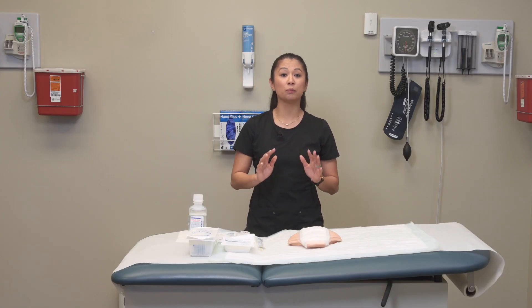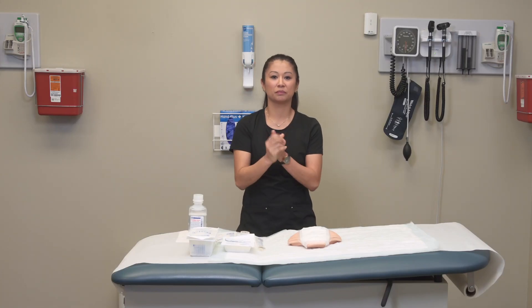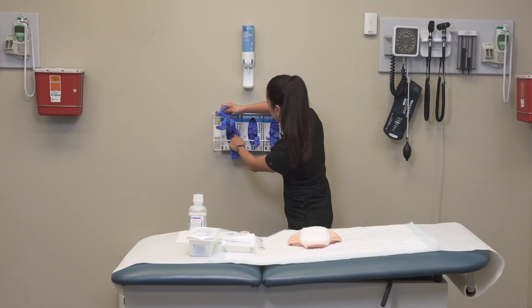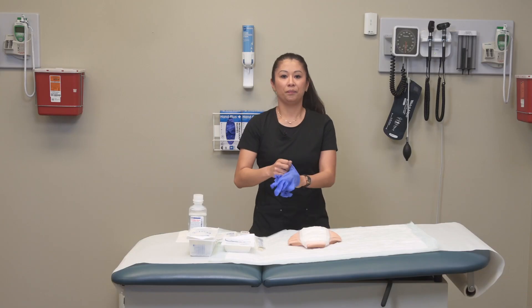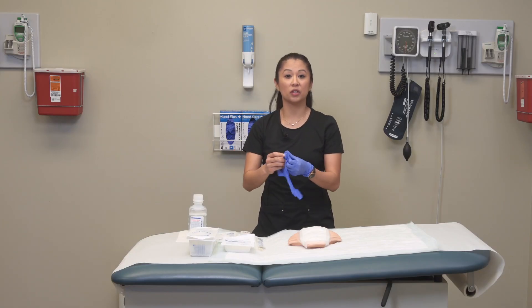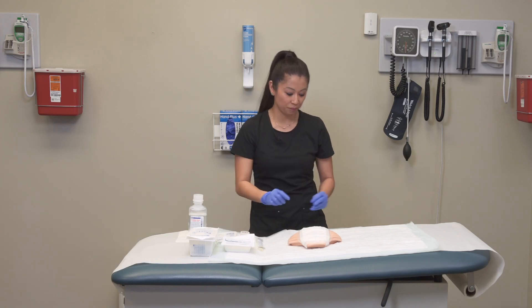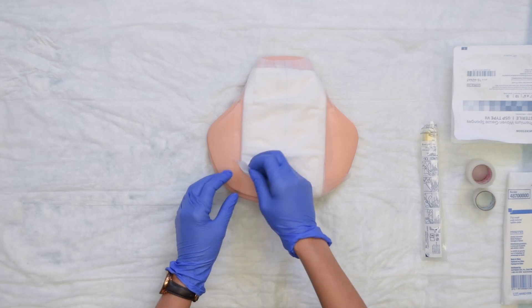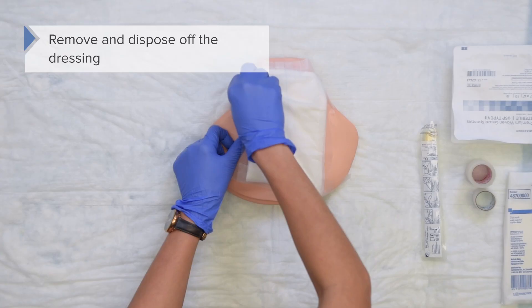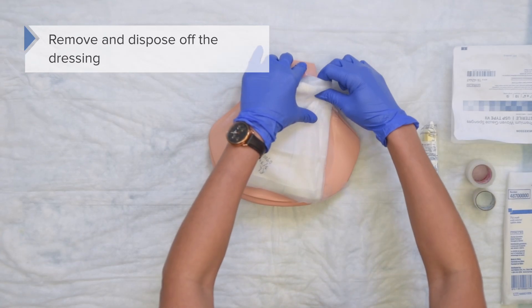Perform hand hygiene and put on gloves. Then go ahead and remove the old dressing to get to the wound itself. Once you've taken off the old dressing, dispose of the soiled dressing and your soiled gloves.